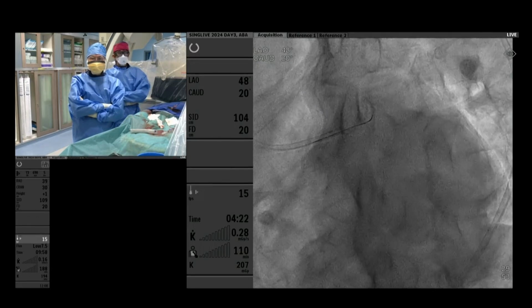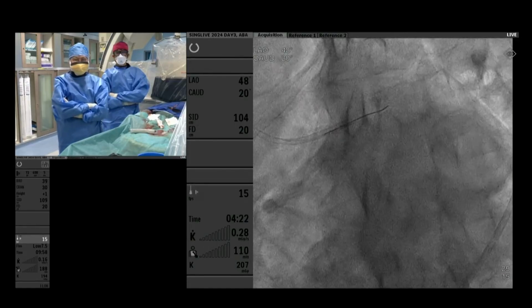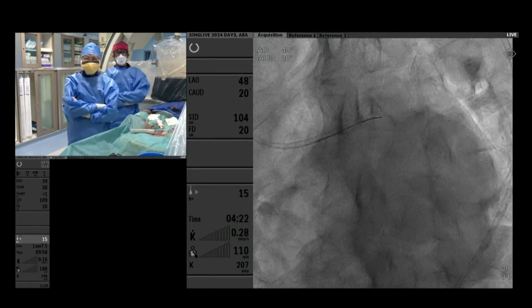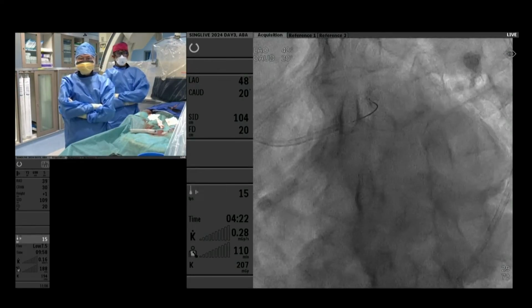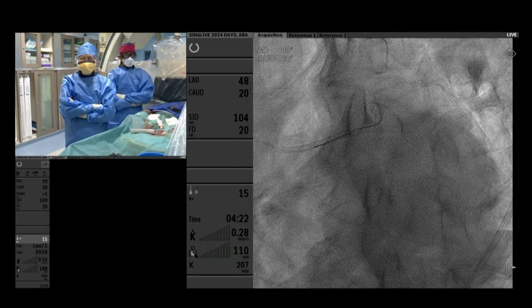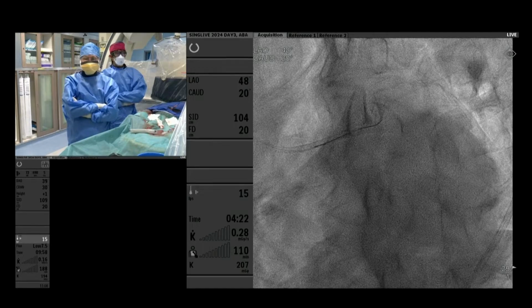We just give a quick diagnostic catheter, cross the aortic valve, and then measure quick EDP. Out of the surprise, even for those high-risk patients in parallel support PCI, we found half of our patients, their filling pressure is not high. Even the EF is 20. CKD 400, for creatinine 400. Out of surprise, some patients will get low EDP. So you need to give fluid, particularly for long procedure. I think this is a challenging left main bifurcation lesion, so you need a lot of further wiring, assessment, and then ballooning. So adequate hydration is the key, apart from minimizing the contrast.